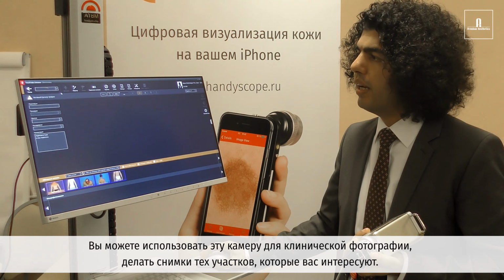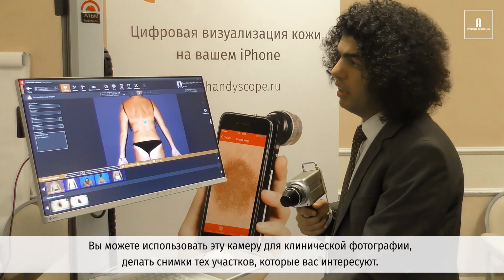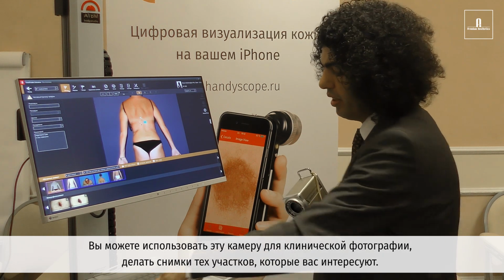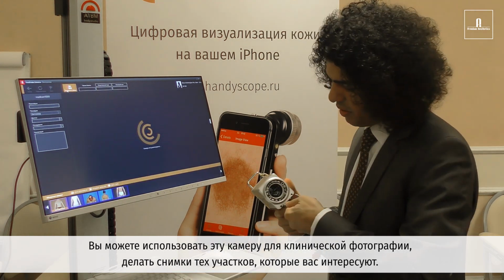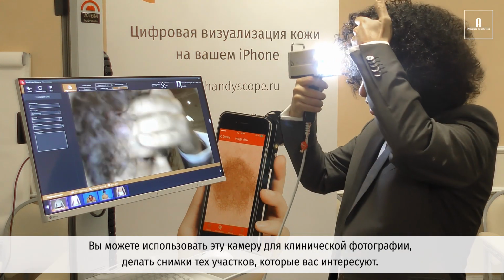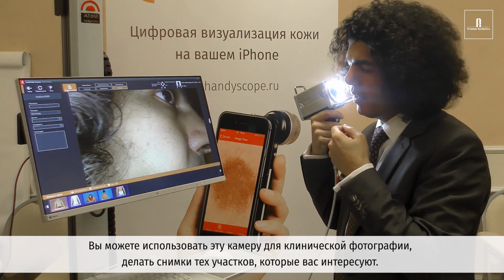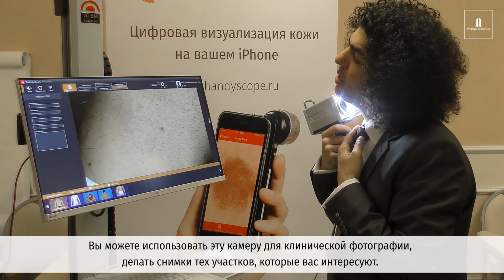So you can use this camera for clinical photography, very popular also when it comes to a standardized way of clinical photography. So you could take pictures, close-up pictures of the area of your interest. So you can basically take a picture of this area, or in this case, you can take the picture of this area where I was now.